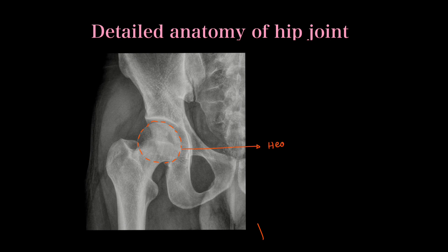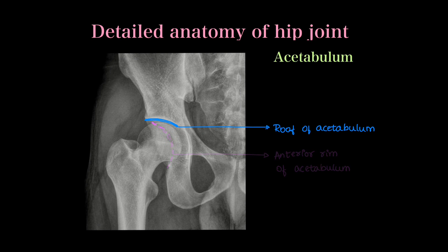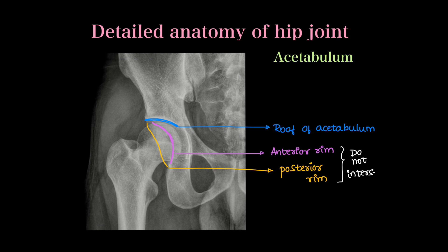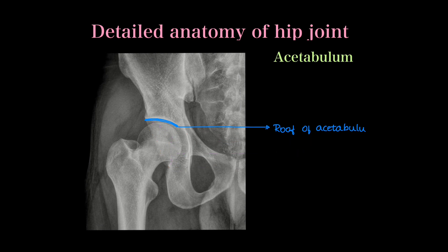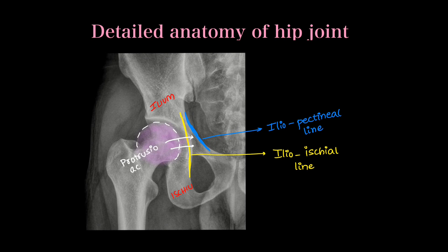Coming to detailed anatomy of the hip joint: this is the outline of the head of femur. The line joining the greater and lesser trochanter is the intertrochanteric line — fractures here are called intertrochanteric fractures. The acetabulum has a roof, an anterior rim, and a posterior rim visible on AP x-ray — these two lines should not intersect. Medially is the acetabular fossa. The ilio-ischial line joins the ilium and ischial bones, and the iliopectineal line runs along the pelvic inlet. If the head of femur crosses the ilio-ischial line, it is called protrusio acetabuli.